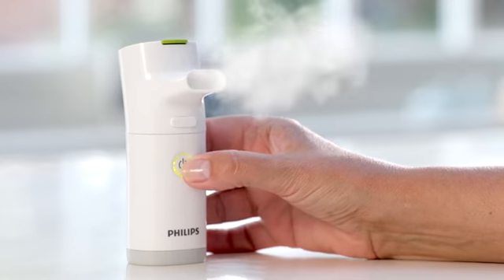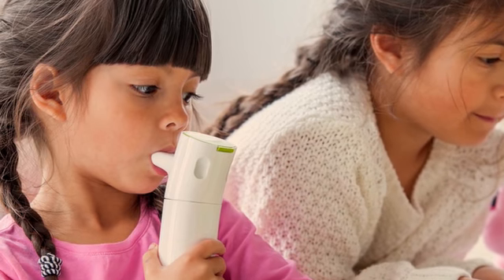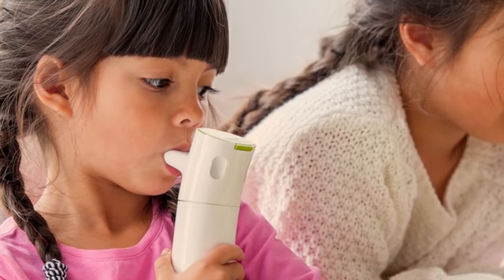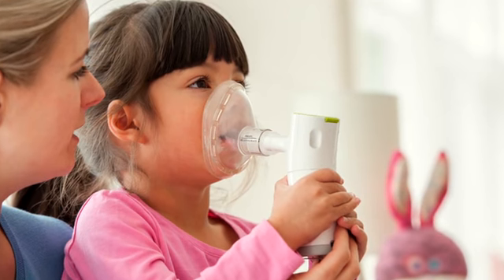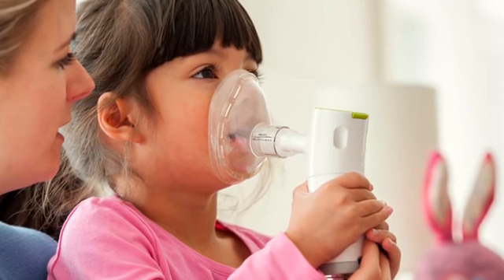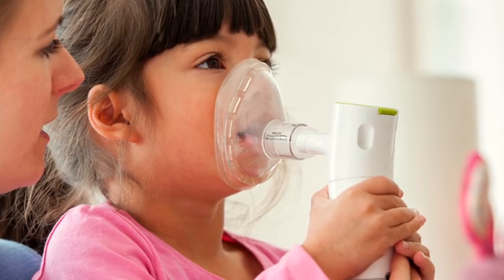Look to make sure that aerosol is coming out of the mouthpiece or the mask. If you're using the mouthpiece, hold the handset in your hand, place the mouthpiece between your teeth with your lips sealed around it and breathe normally through your mouth. Do not tilt the handset more than 45 degrees in any direction during treatment, as this might stop it from completely nebulising the medication in the chamber.